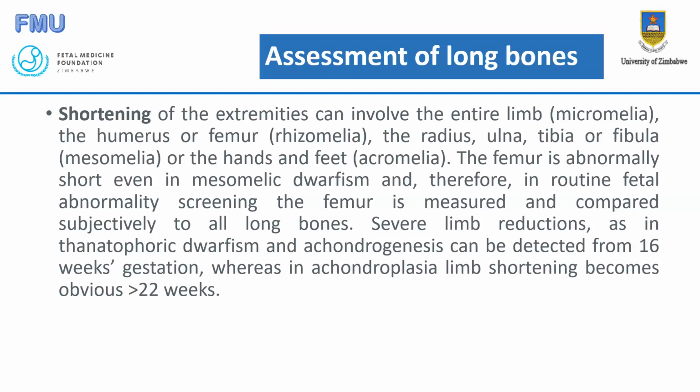Otherwise, you may see somebody with a short skeletal dysplasia baby. They come at the 20-week anomaly scan. You do the routine anomaly scan, and everything looks normal. You cannot reassure the woman and say, "Look, you're okay," because it will be too early. Because the shortening happens as you enter the third trimester for most of these cases.